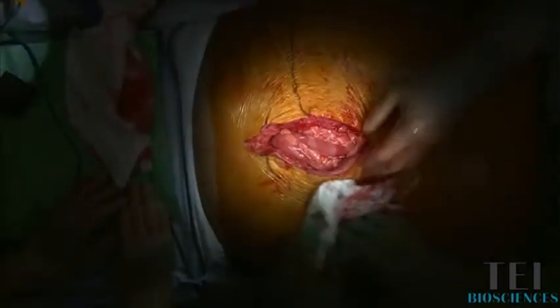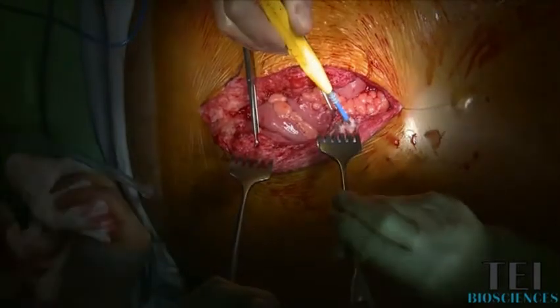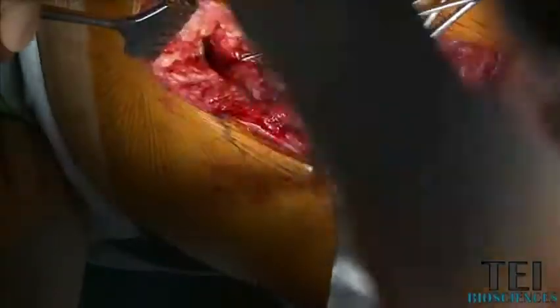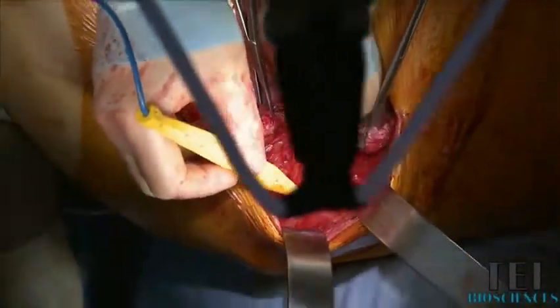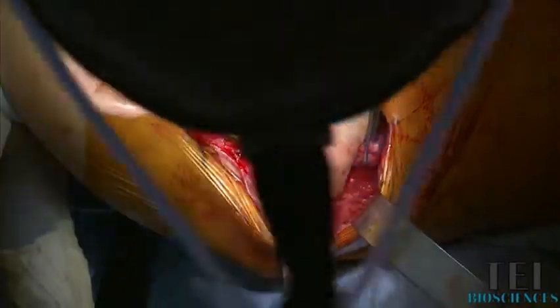We'll start here by elevating the fascia. You have to free about three to five centimeters of fascia. Now we reach the point where we want to do the component separation. The aponeurotomy has to be between the linea semilunaris, which is the end of the rectus sheath, and where the fusion of the external and internal oblique are.